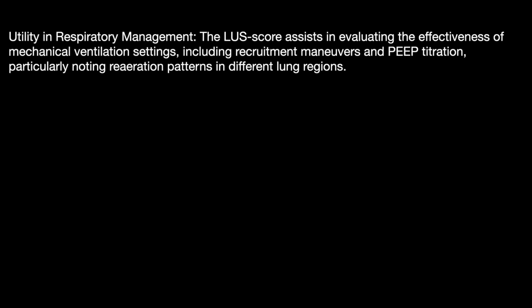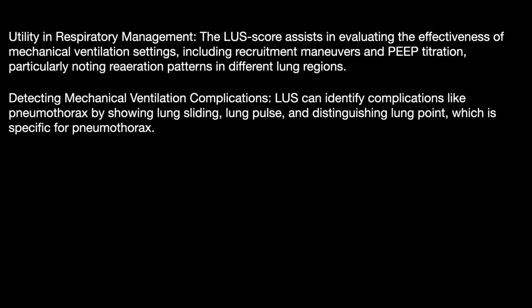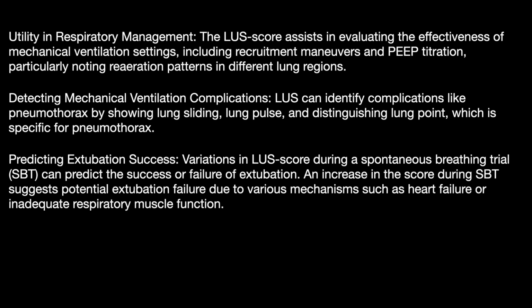Now, the lung ultrasound score assists in evaluating the effectiveness of mechanical ventilator settings, including the recruitment maneuvers as well as the PEEP titration, particularly noting the re-aeration pattern in different lung regions. Lung ultrasound can identify complications like pneumothorax by showing the lung sliding, lung pulse, and distinguishing lung point, which is specific for pneumothorax.